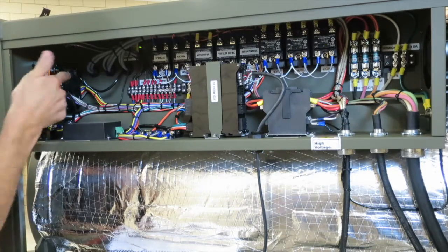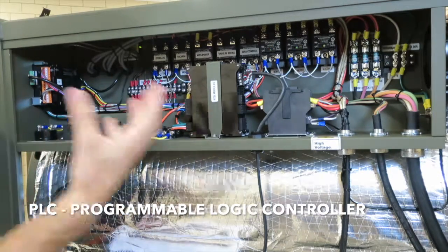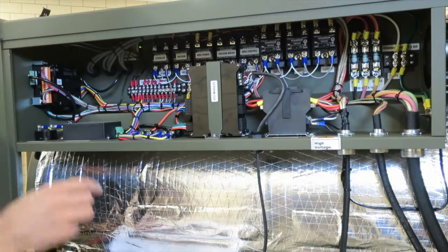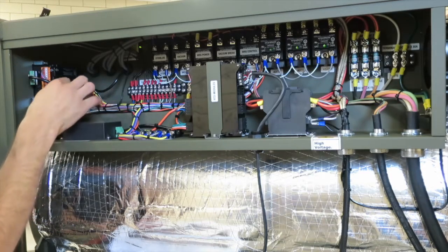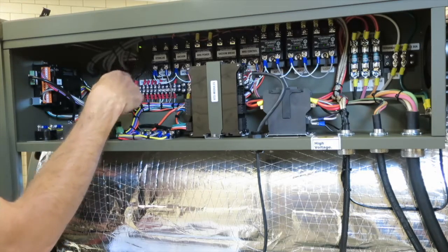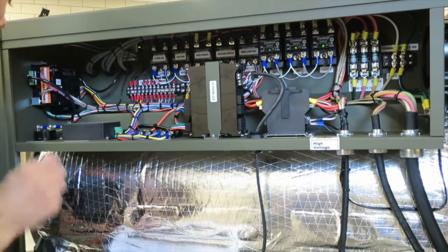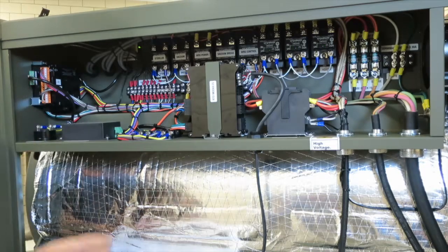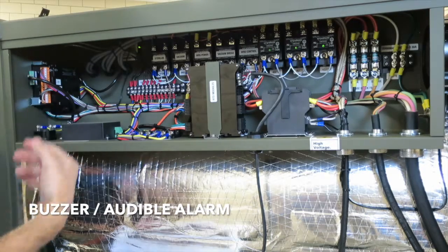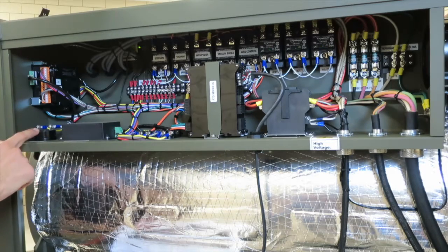Right here on the left we have the PLC. This is the brains of the unit that controls all the valves, reads the temperature, reads the pressure. It's what the user interacts with on the front with the touch screen. So you'll see that we have some input wires coming here. We also have some output wires coming here. And then we have the temperature coming in right here. So that's the PLC. Right here we have a buzzer alarm. Anytime you hear this unit beep, whether it's 1 time or 3 times, that's coming from the buzzer alarm right here at the bottom.